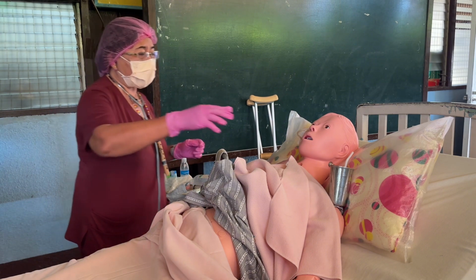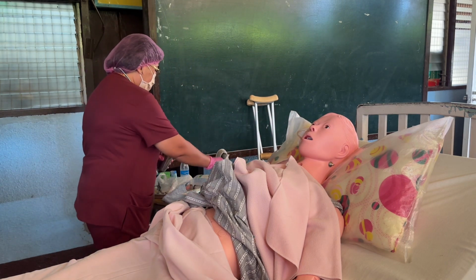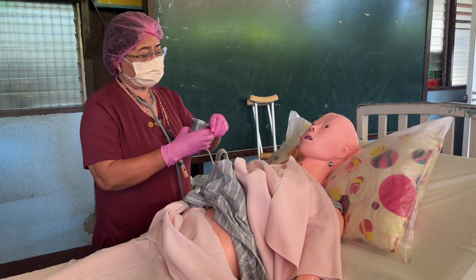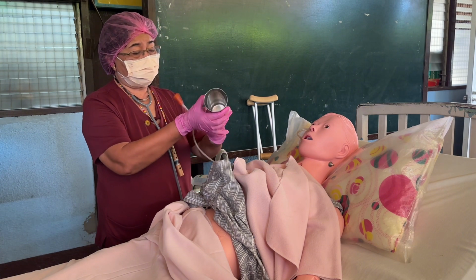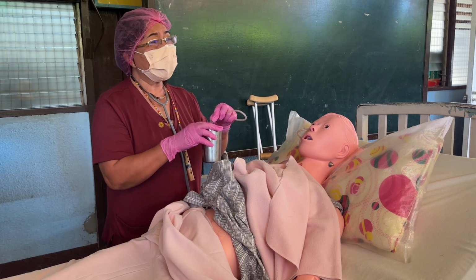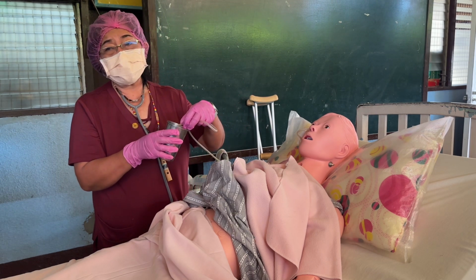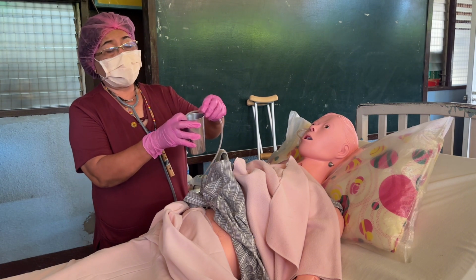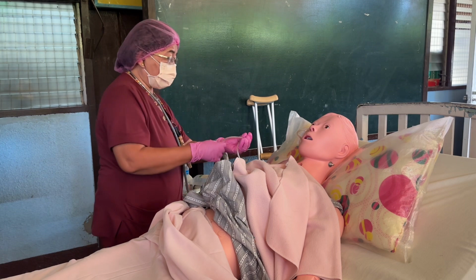The second way to check, the gastric juice that came out. And then, this is filled with water. You submerge one end of the NG tube in the water. Submerge it before you unkink. Submerge it first, no? Then you unkink. There should be no bubbles that appear in the water, or else it is an indication that the tube is in the lungs. So, no bubbles. Then you pull it out, no bubbles. Then kink again. Remove from the water. Okay. Then you lock.